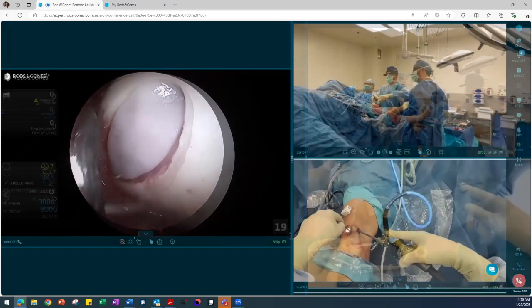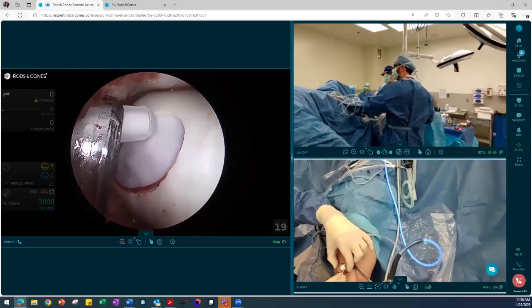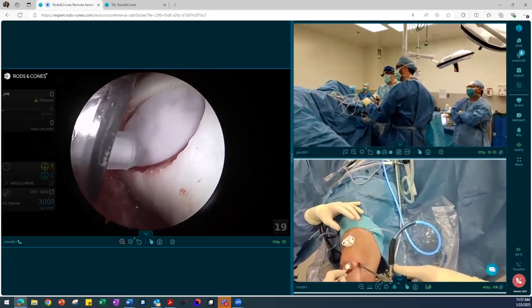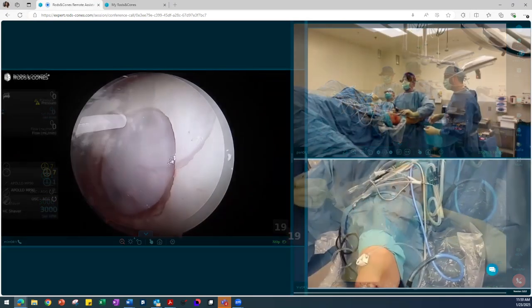You can see here we have an excellent fill, and what we're going to do now, as you can see, is one more slight adjustment to remove any air bubbles, and after that we can start doing the final Tisseel glue. So you'll wait 3 minutes, and then we'll place another round of Tisseel and wait 3 more minutes.